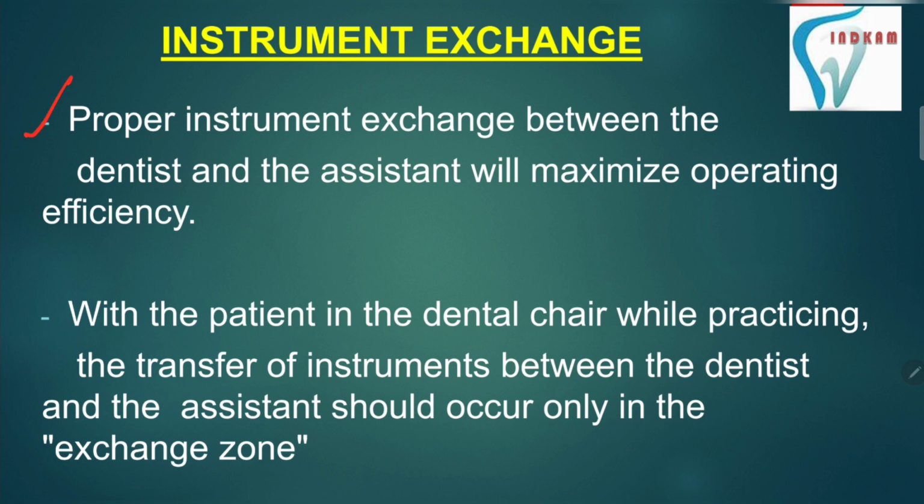Proper instrument exchange between the dentist and the assistant will maximize the operating efficiency, which is must nowadays. With the patient in the dental chair while practicing, the transfer of instruments between the dentist and the assistant should occur only in the exchange zone.